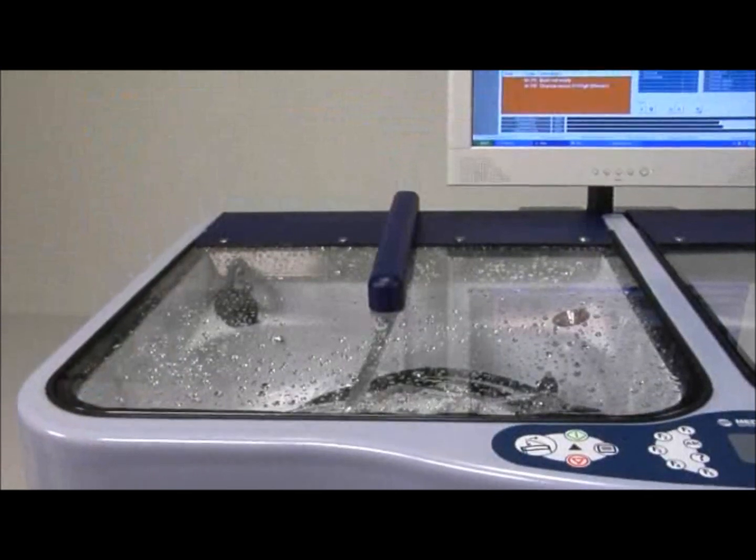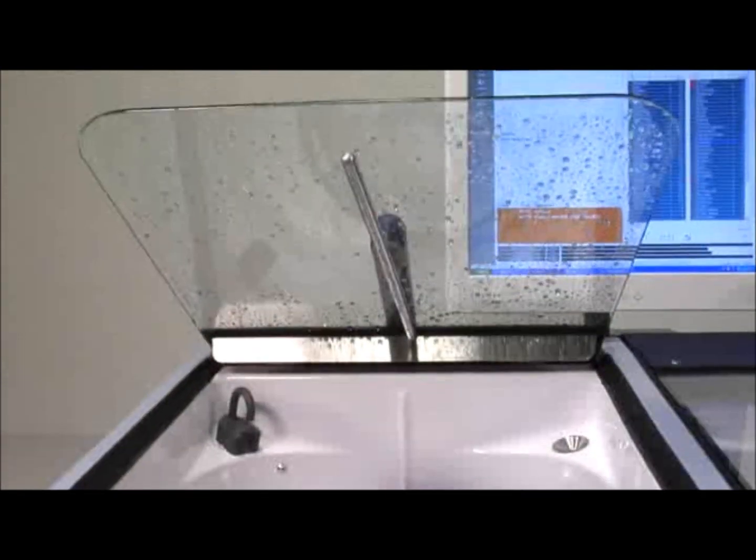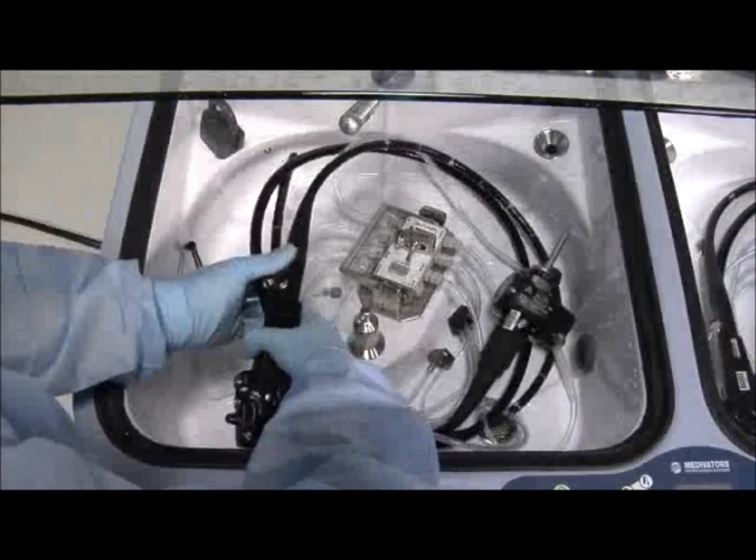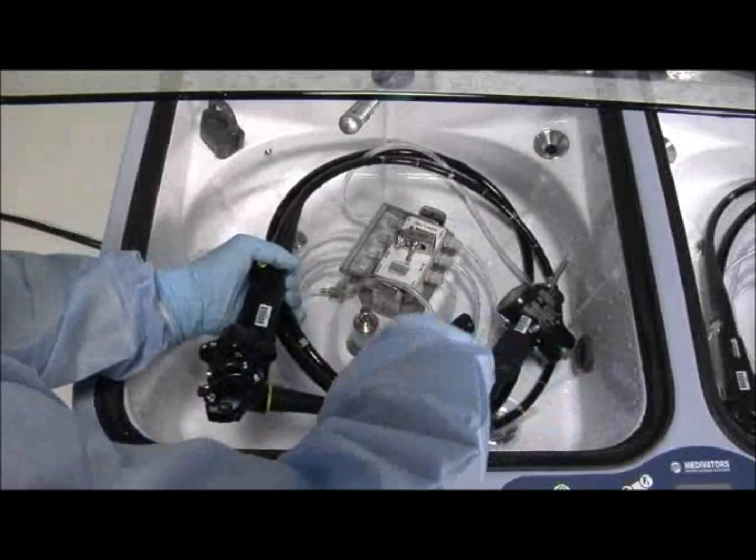Press the open close button or foot switch to raise the basin lid and scan your operator ID barcode. Disconnect all connectors from the endoscope.